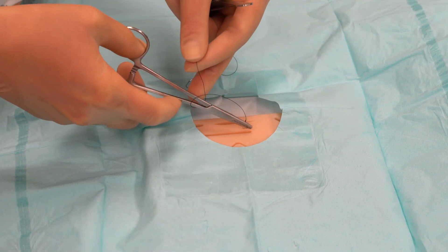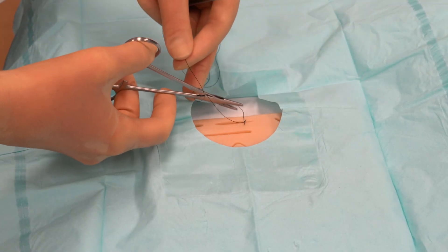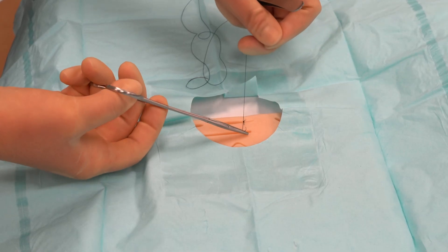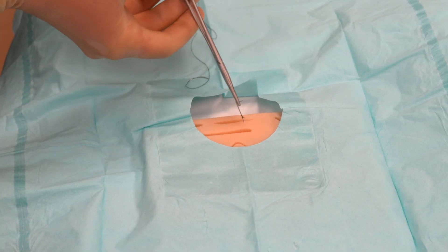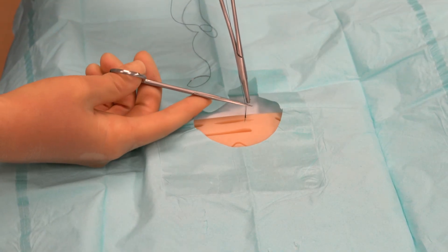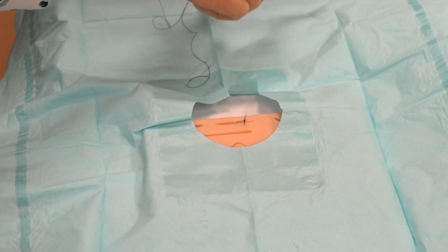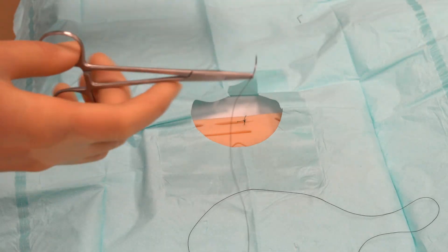I'm going to do this two more times for a total of four ties — the first was the surgeon's knot with two wraps, and the other three are just one wrap each. Then I lock the needle driver onto the short end, transfer it to my left hand while holding the long end with the needle in my right, grab the scissors, and cut both tails together — nice and even, about five to eight millimeters. Sutures have to be taken out later, so don't cut the tails too short — leave them long enough to pull out.